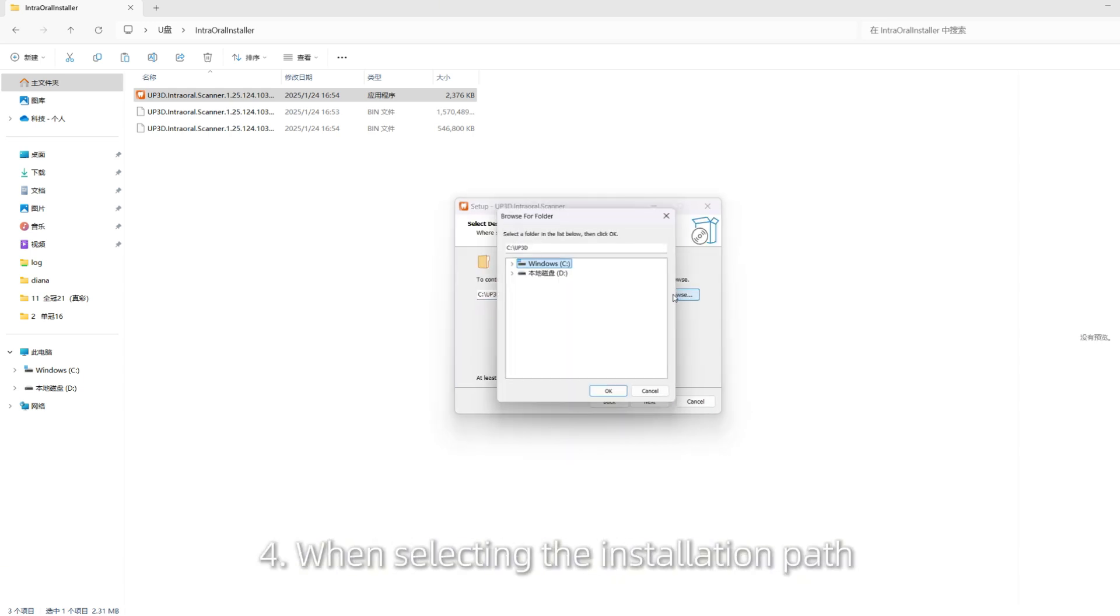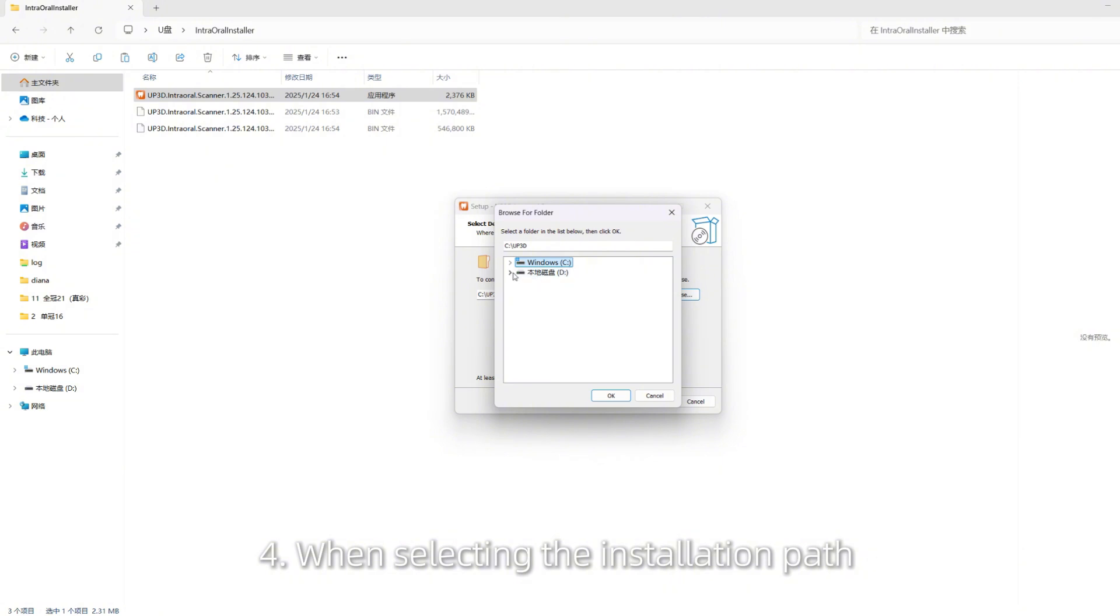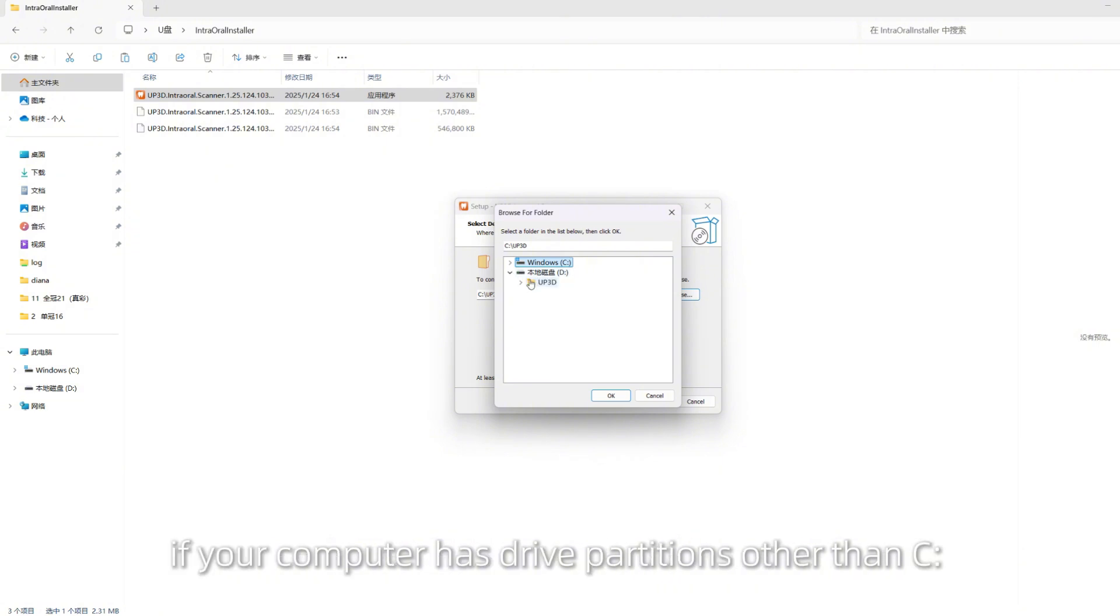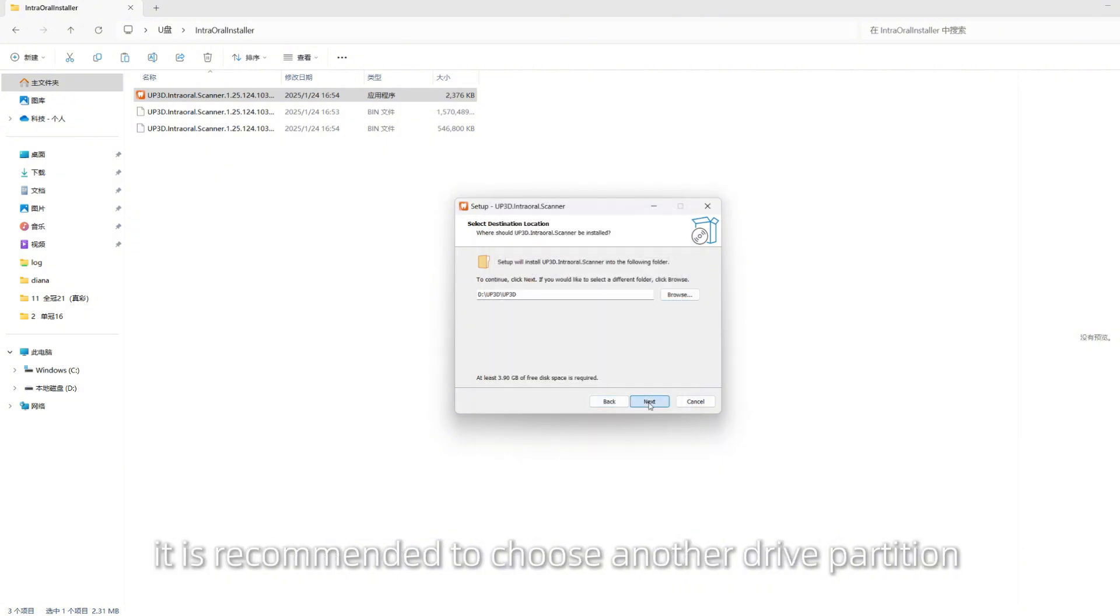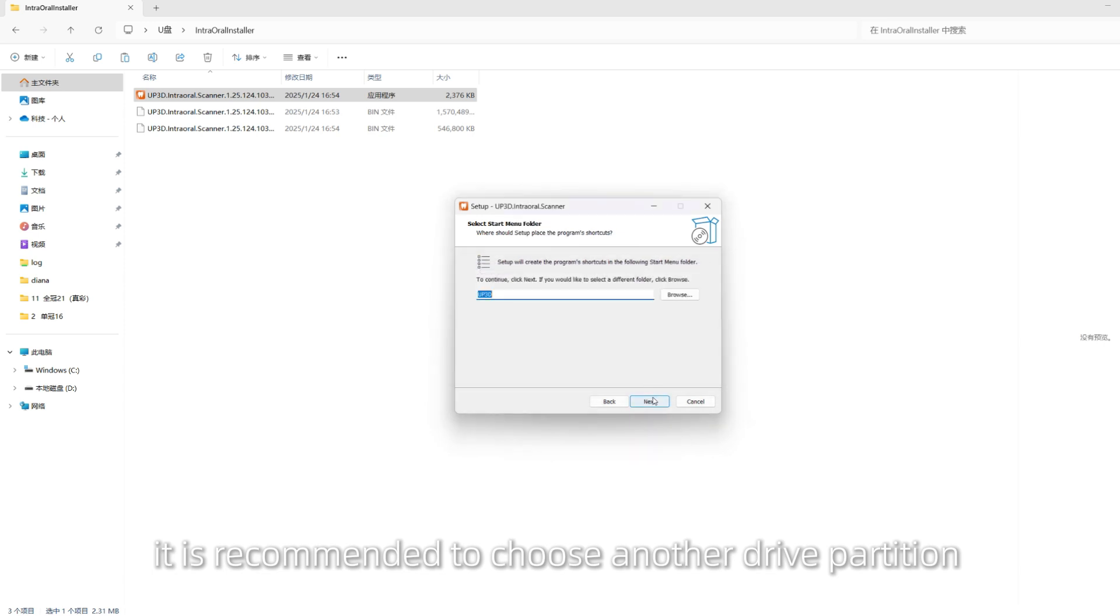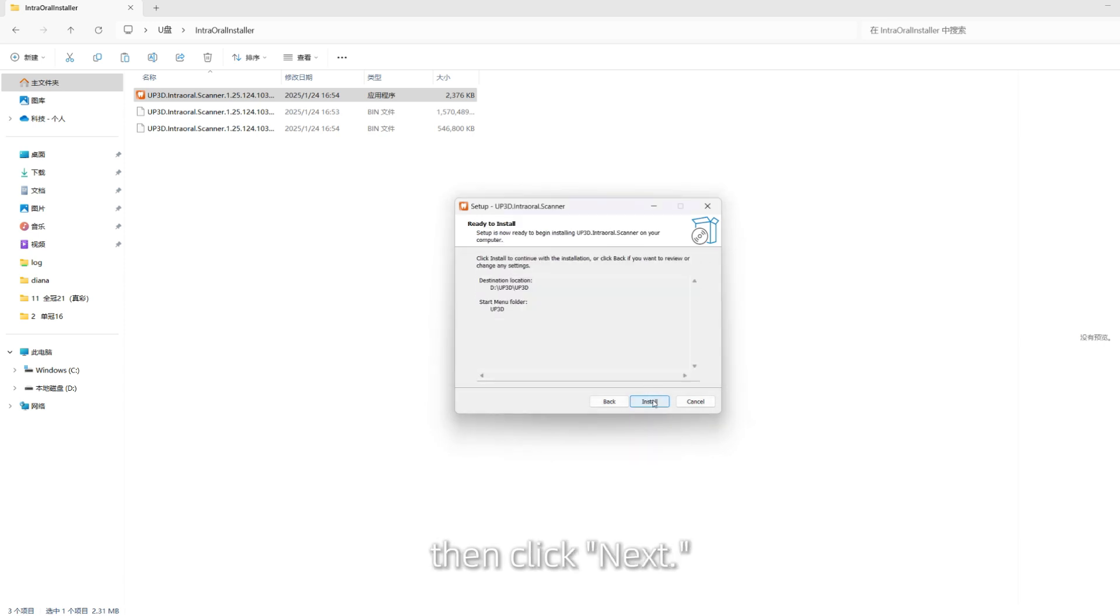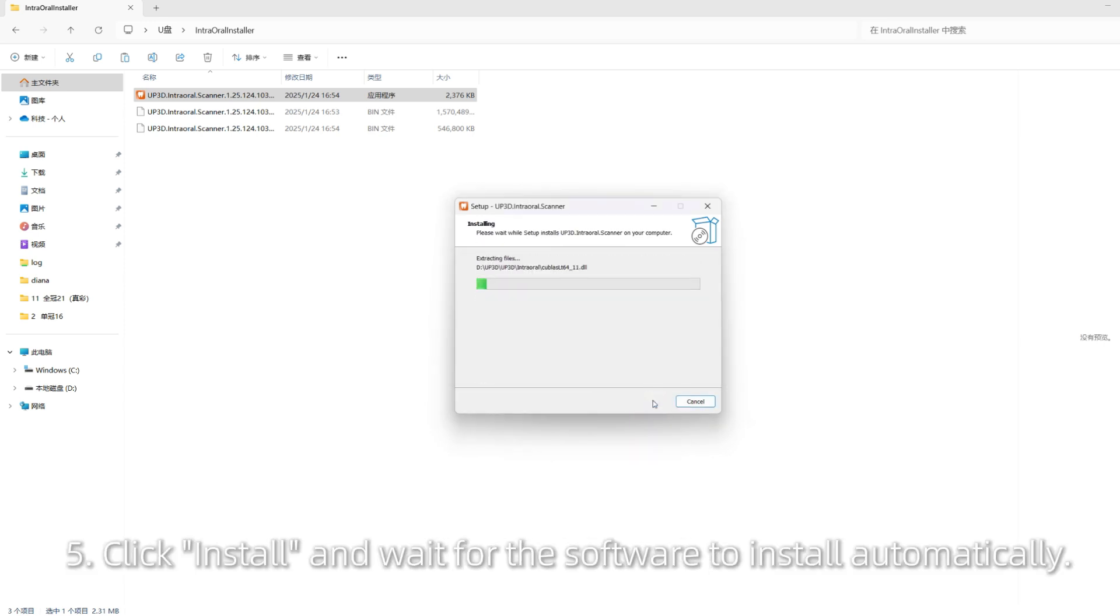When selecting the installation path, if your computer has drive partitions other than C, it is recommended to choose another drive partition, then click Next.